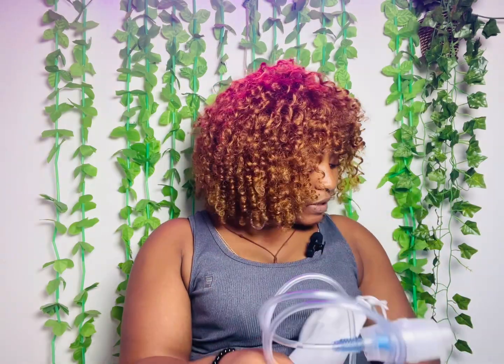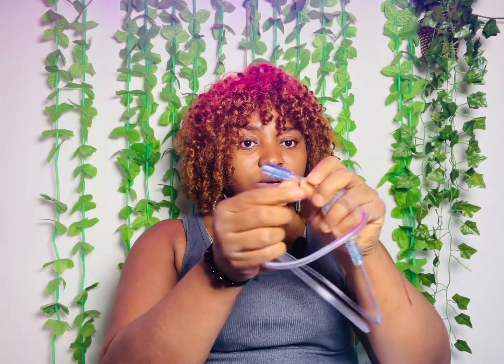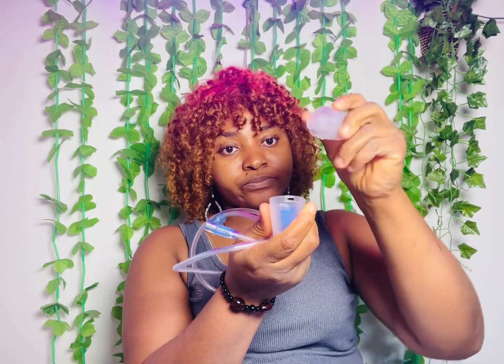Now let me explain what this one does. This is the tube that you have to insert in this particular place. Let me take it up. Now we have it like this. You are going to take this out from the product, and you are going to open it.